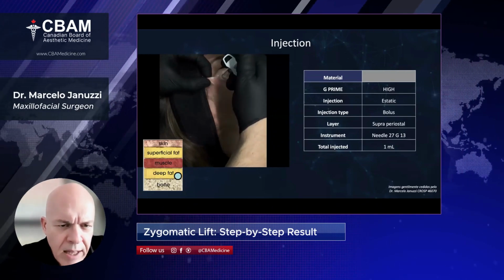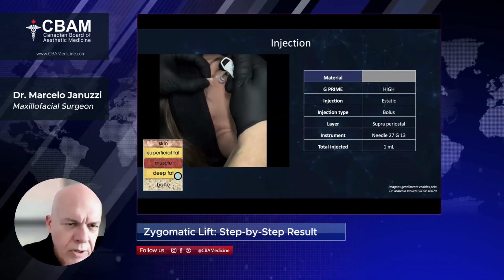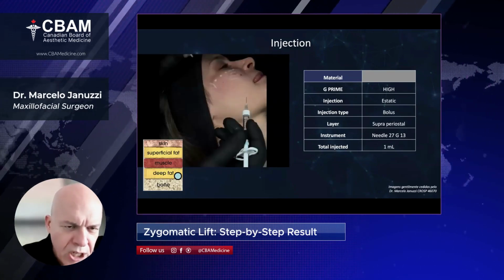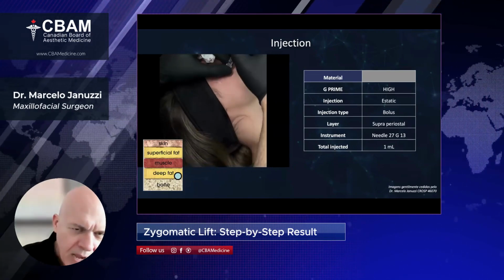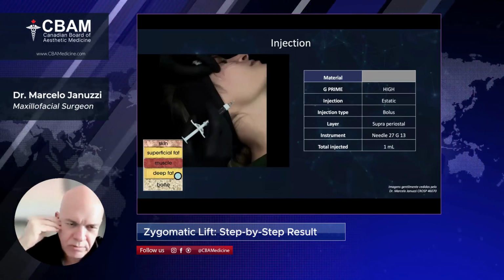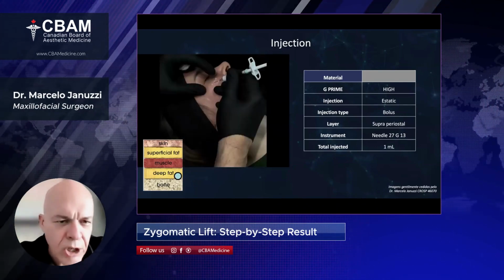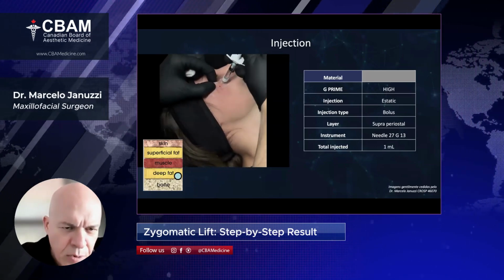So the injection normally is with needle. The left hand makes some traction to the tissue in the temporal direction. So I put the needle over the mark and stretch the tissue in the temporal area, so the needle touches the bone, perforating the skin in another position.